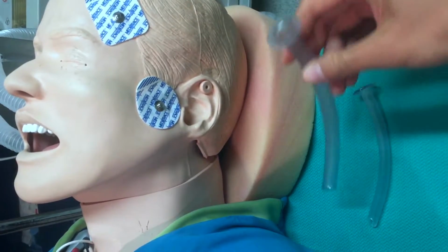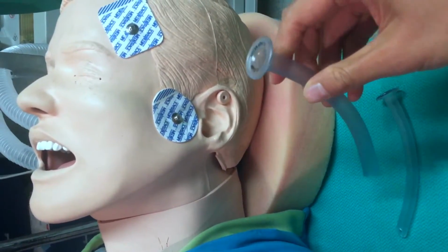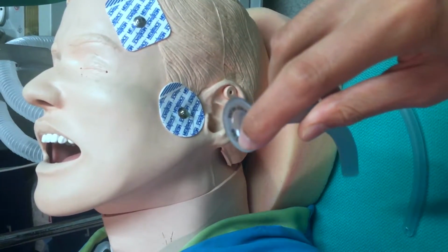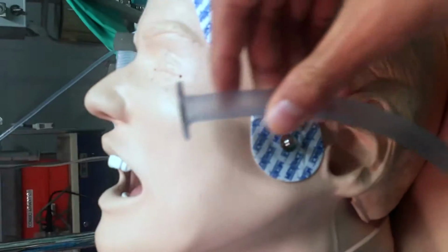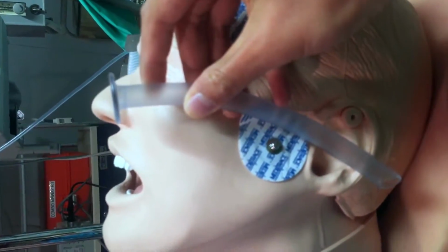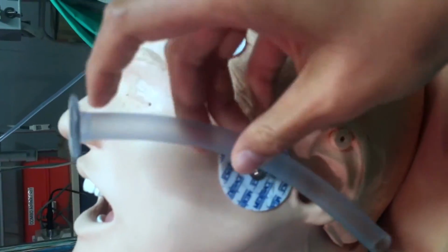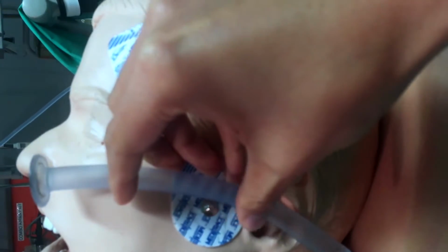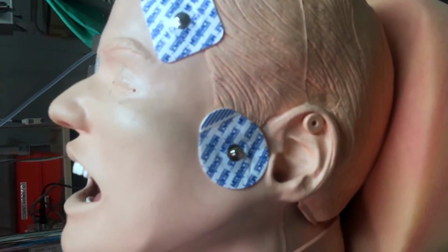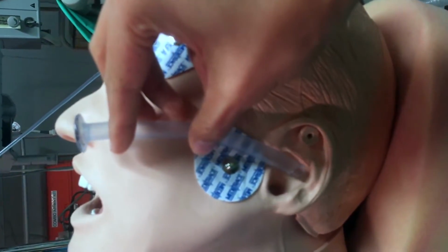So the best way to put this in a patient, you want to measure it first. This is the flange, this part. You want to put it on the outer border of the nare, and the tip, this part, should reach but not exceed the external auditory meatus. As you can see, I am definitely going past that, so I would try maybe a smaller one. We'll see. Oh, this is perfect.